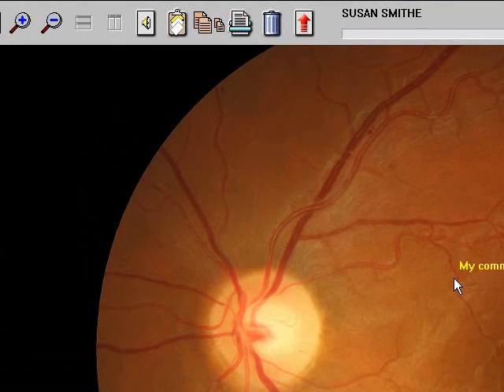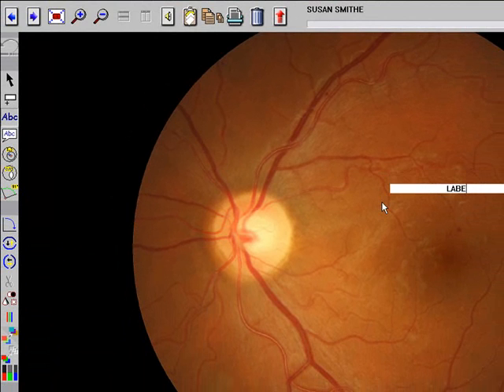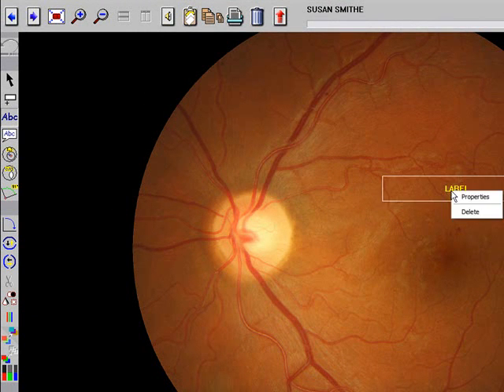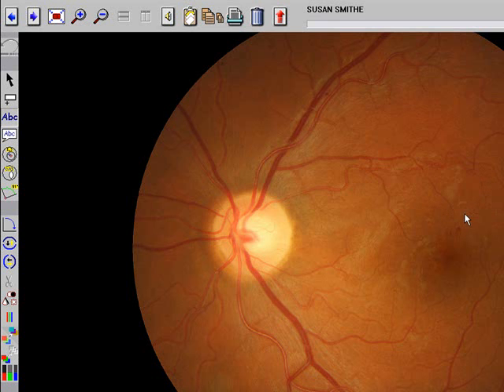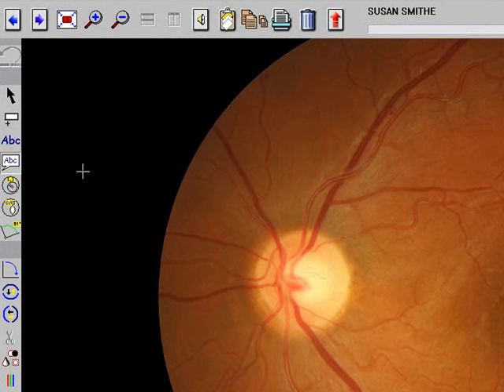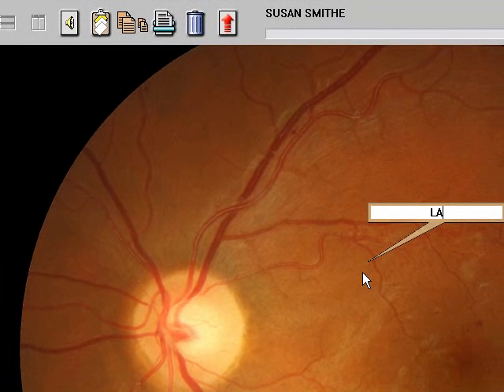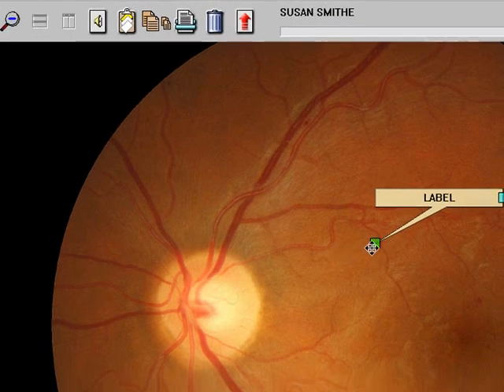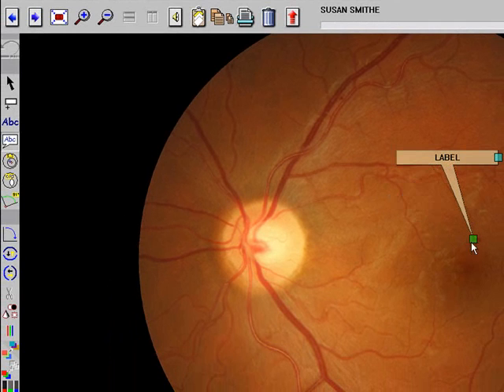To annotate an image, open an image and left-click on the ABC button on the left side. Click in the area that you wish to label, start typing the label, and click off on the retina. If you wish to remove that label, right-click and left-click Delete. To add a label with a tail, press on the ABC with the tail, click on the image, start typing, then click on the label and drag the tail to point to the pathology.